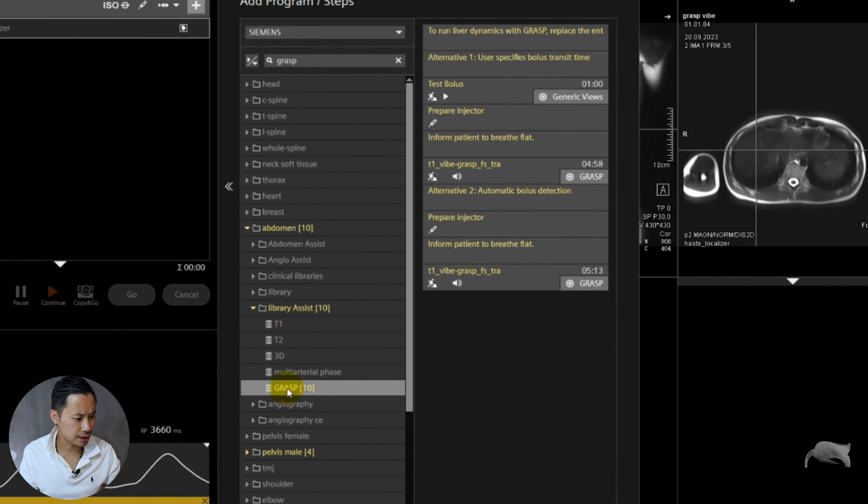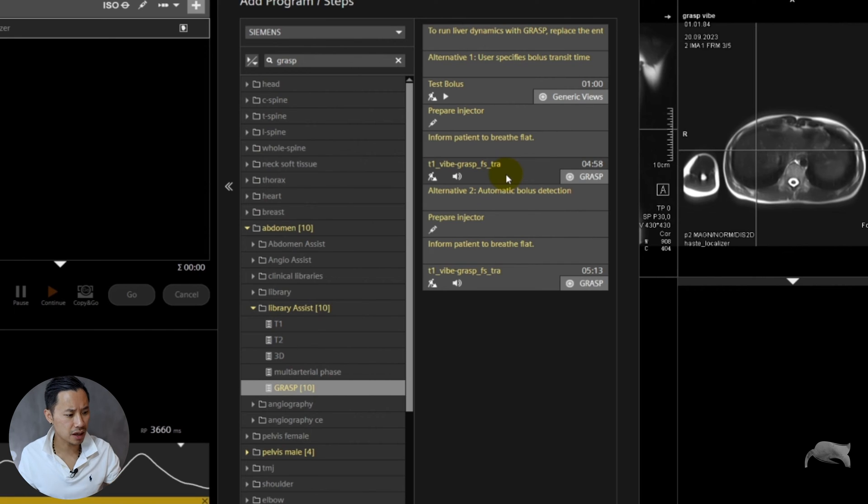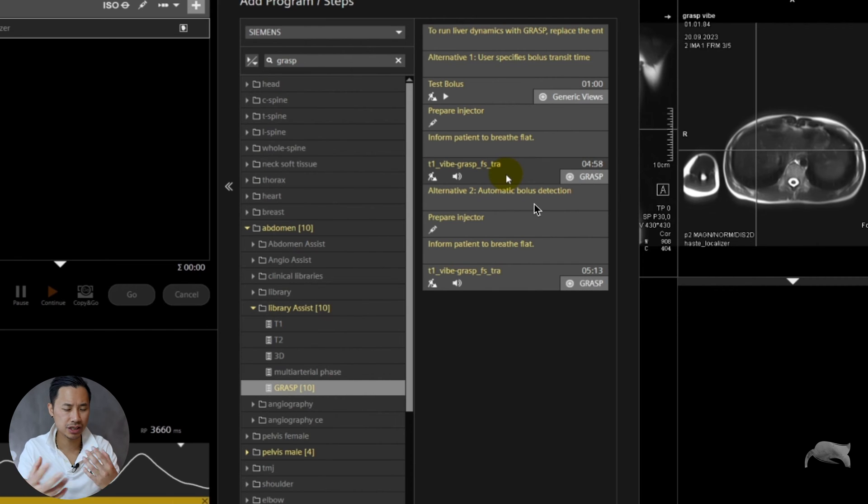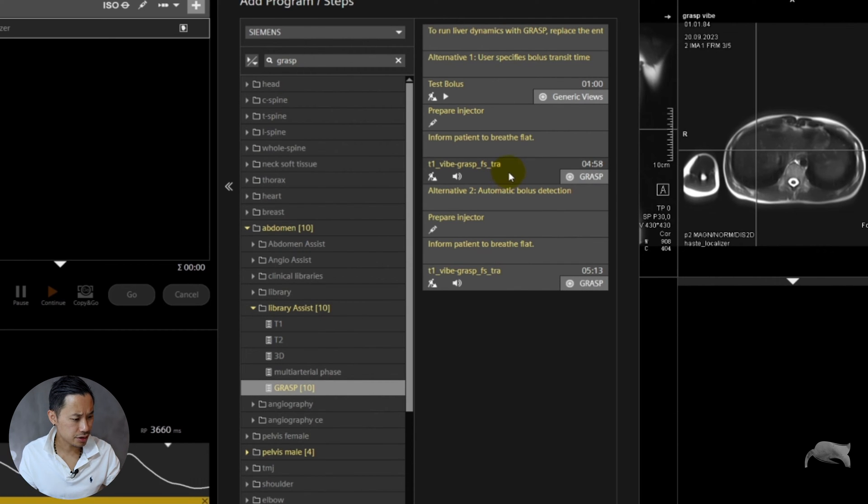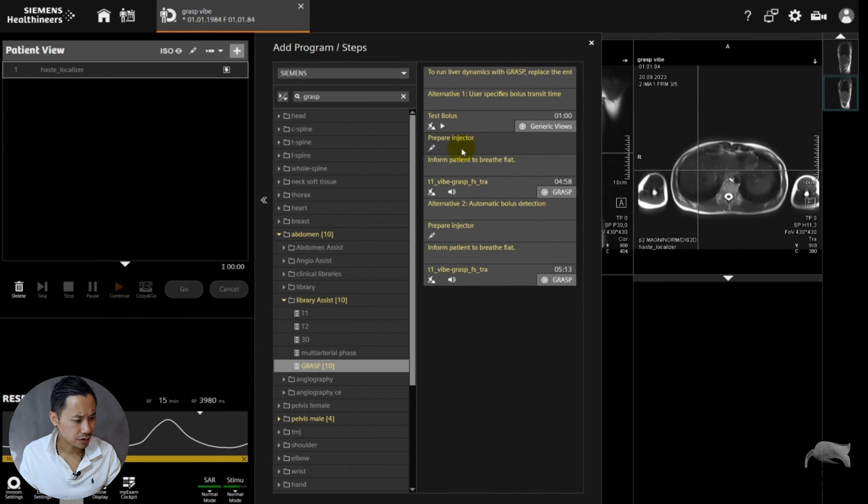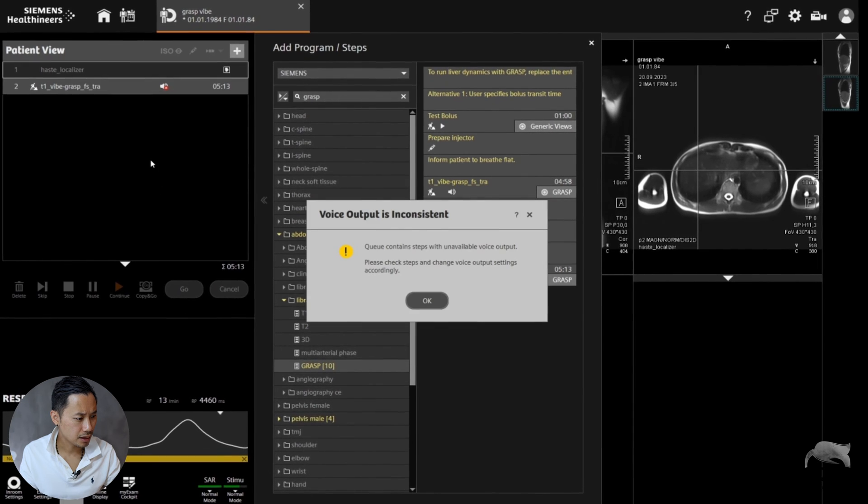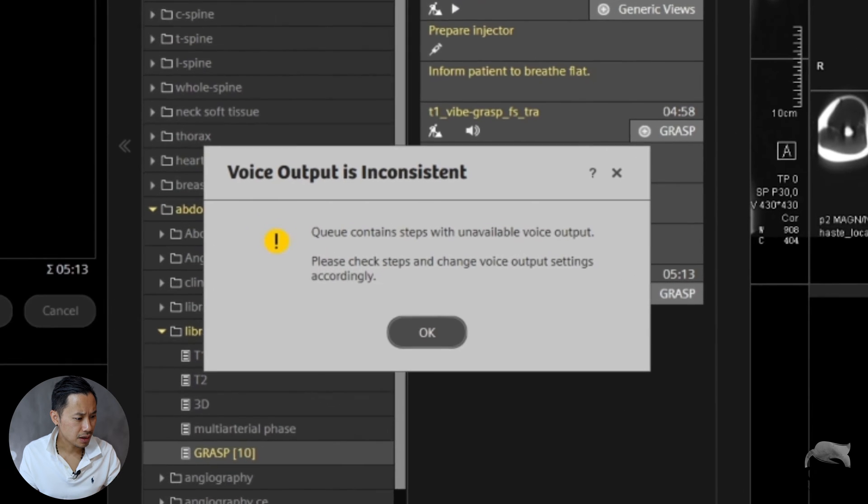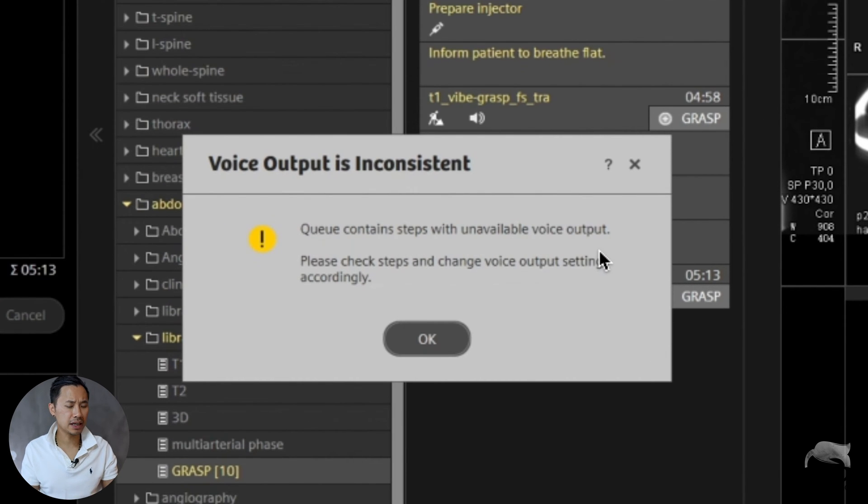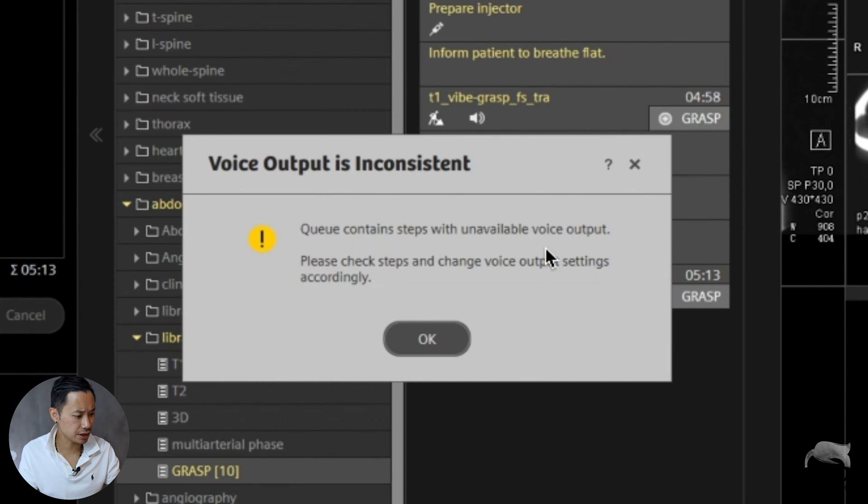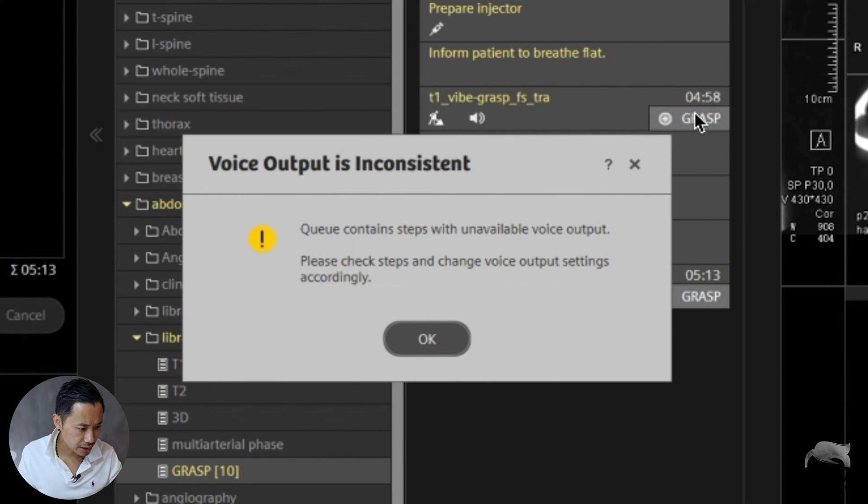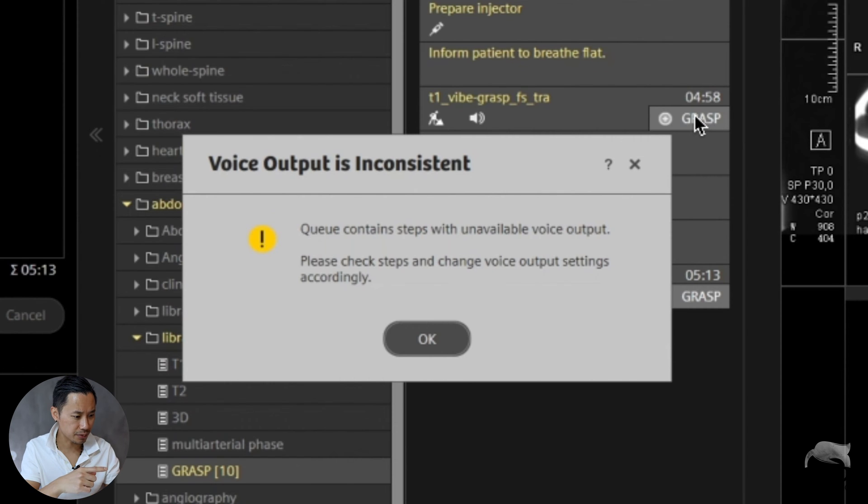You can see this in the folder of abdomen, in the folder of pelvis, and in oncology folder. Let's just go for abdomen folder. Inside this folder you can see the GRASP VIBE right there. You can see there are two versions - one with the test bolus, next one with the care bolus detection which is more automated bolus technique. We're going to go for the last one and try to optimize that.